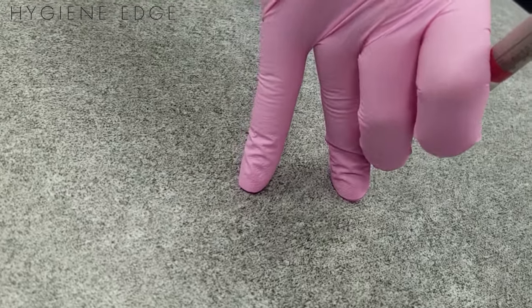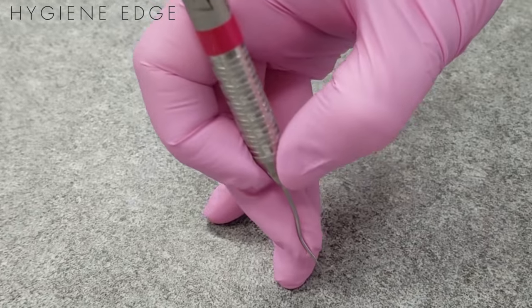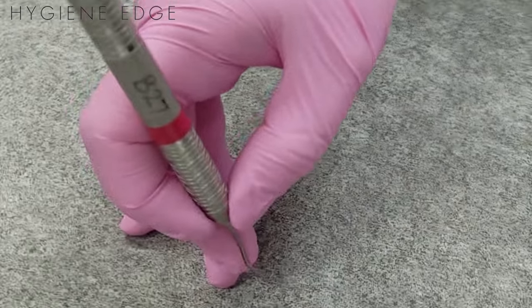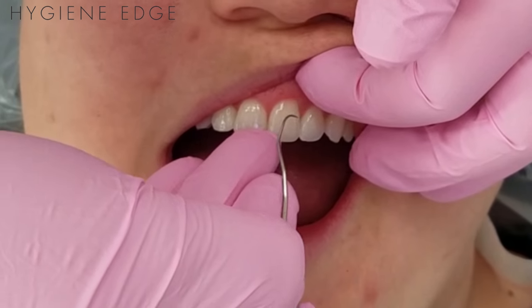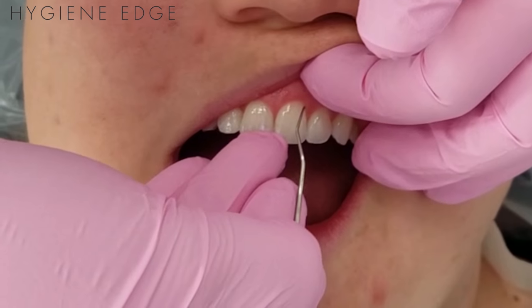Although they can't be separated, the middle finger can move up and down along the side of the ring finger. To avoid separation while working intraorally, remember that the fulcrum finger must move position when you move to a new treatment area.